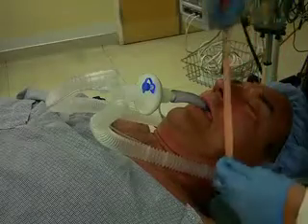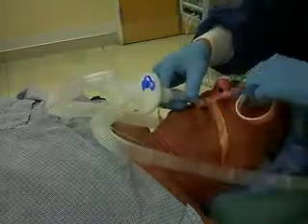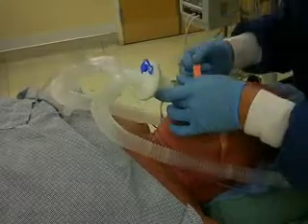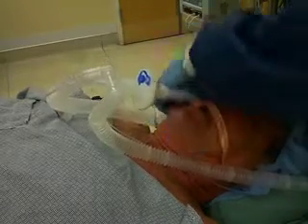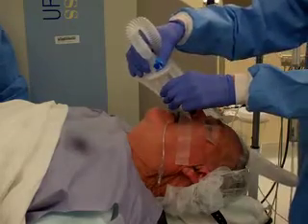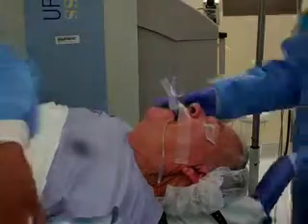Once adequate ventilation has been established, secure the laryngeal mask airway with tape to prevent movement of the device. Even when secured, the laryngeal mask airway may become dislodged with motions such as twisting or pulling. When moving patients, place one hand at the base of the laryngeal mask airway and disconnect the ventilation system from the device.